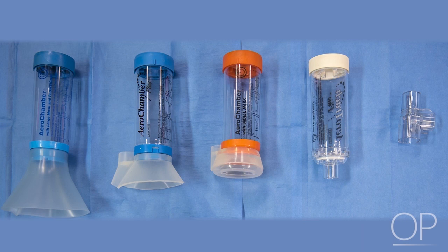We have several different interface options. Depending on the patient's size, we have different masks and different sized chambers. Additionally, we have spacers that are built for endotracheal and/or tracheostomy tubes. Also, we have inline MDIs, which can be used during mechanical ventilation.